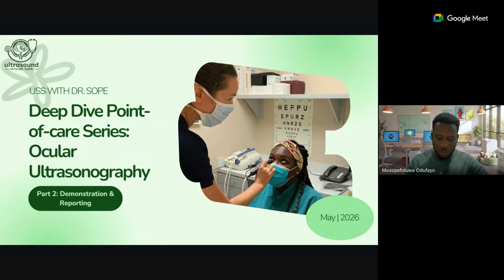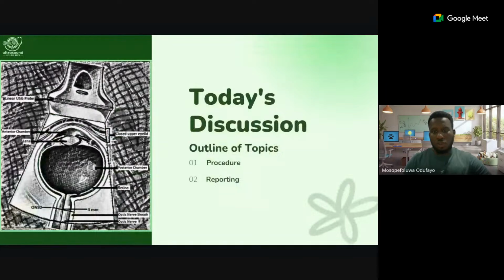Is that okay? So, ocular ultrasonography, point of care, how to do it most efficiently, and that's what we are about to talk about. So we begin. On today's discussion, we're going to be talking about the procedure, and then the reporting.